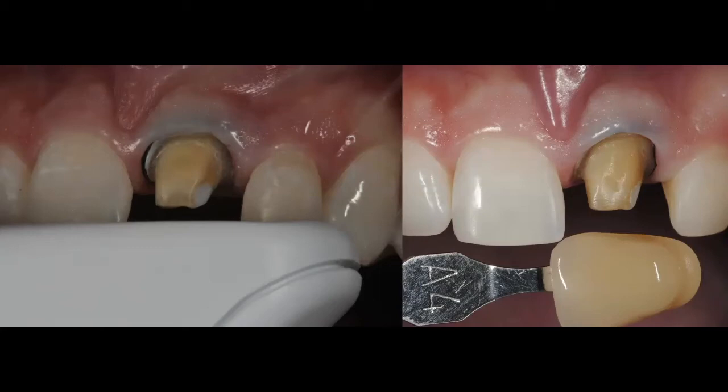We had a dark substrate, and what I'm going to do right now is take a photo of a shade. You can use a Stump shade guide, or you can use just a regular shade guide. I always use the darker shade tabs. And all I'm doing here, and you can see, I'm just trying to tell the lab, hey, by the way, underneath this crown that we're going to select, this is the shade that we have.